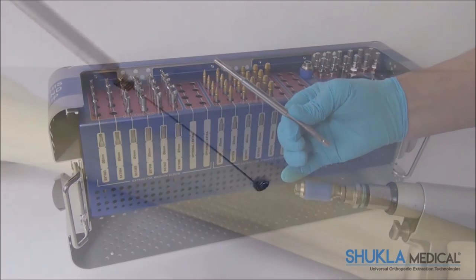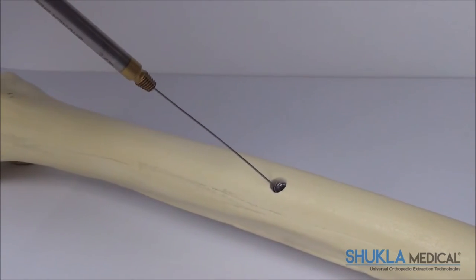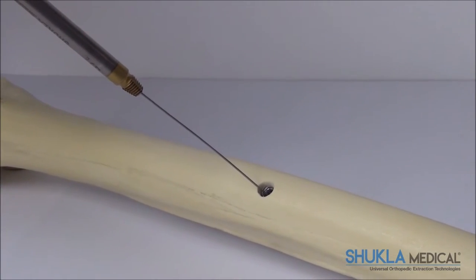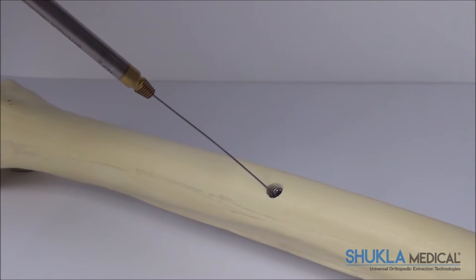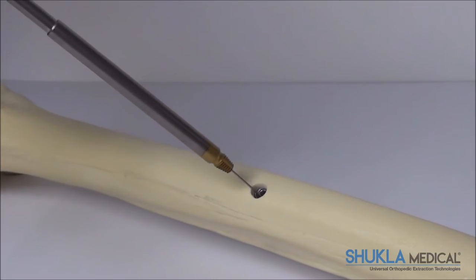Once the screw has been removed, the screw and extractor are simply discarded. The extractors are cannulated, allowing the surgeon to follow a K-wire down to a screw embedded in the bone, or deep in soft tissue.